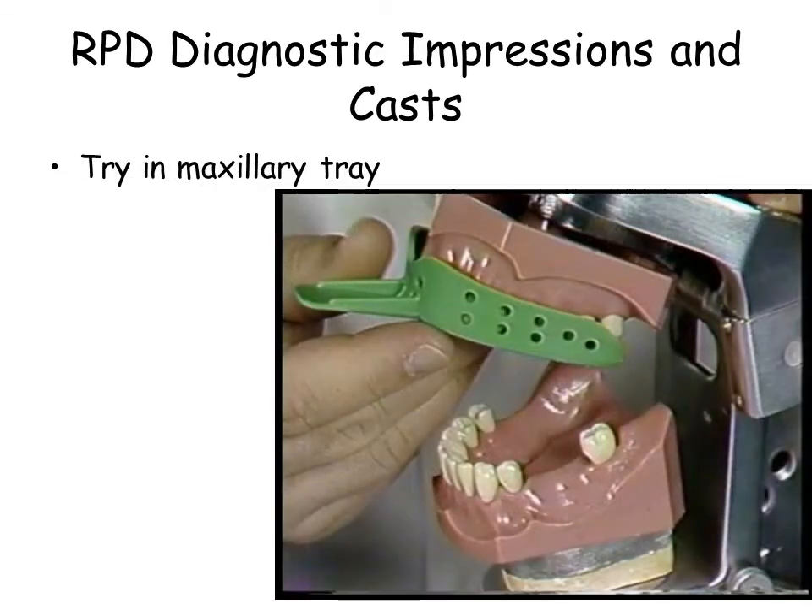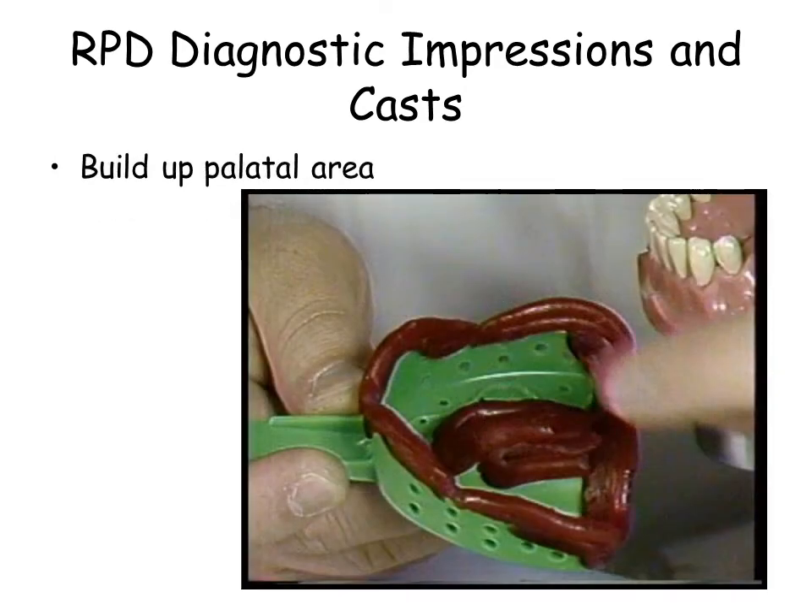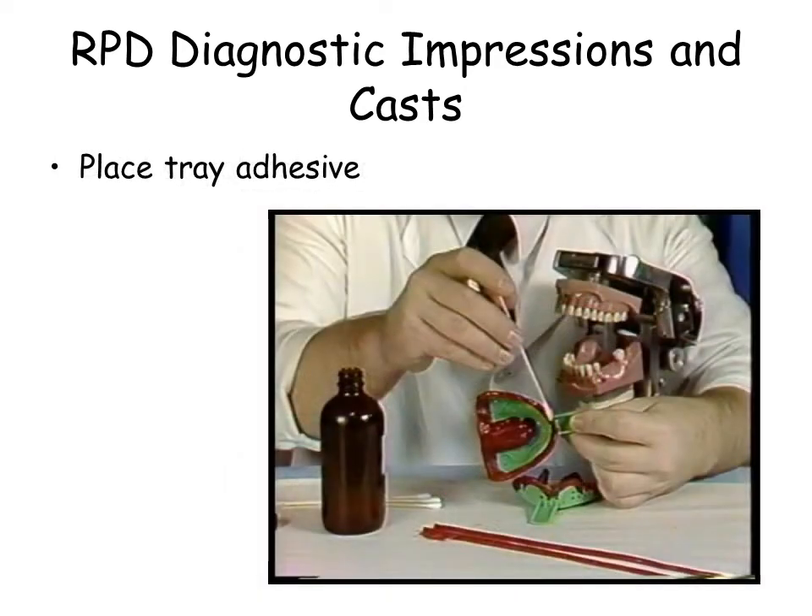Try in the maxillary tray. Add wax to the borders of the maxillary tray. Build up the palate of the tray with red rope wax. Place a liberal amount of tray adhesive on the tray, wax, and external border of the tray.